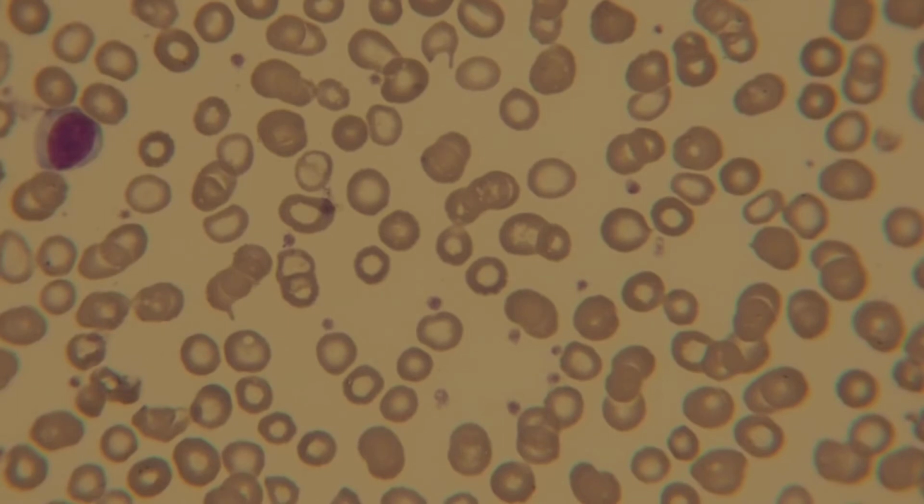The MCV is altered, and sometimes the RDW is exaggerated. And it's not because the RDW is true, it's just because the machine looks at a stack of those cells and sees those cells as one big giant macrocyte. So right now, this person actually has a microcytosis. You can see some of those cells are really small.